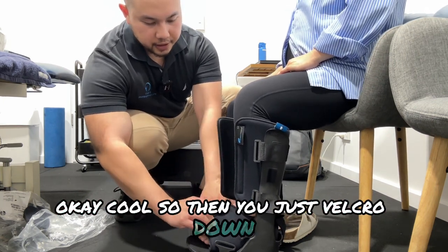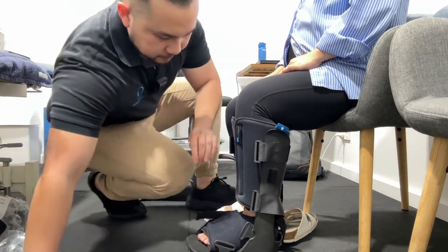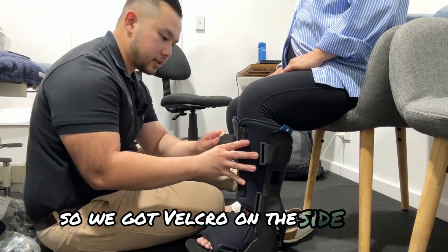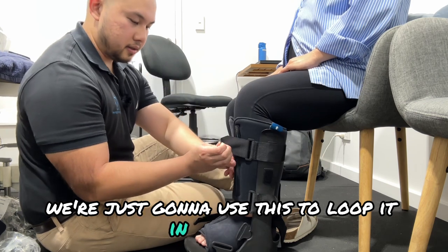Then you just velcro down. And this is the fun part — we've got velcro on the side here and we're just going to use this to loop it in on itself.